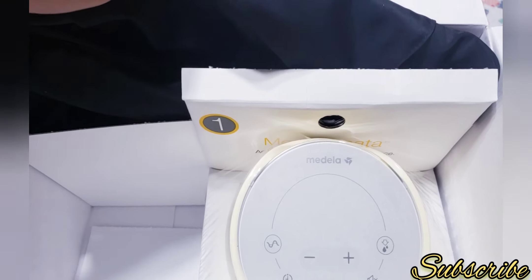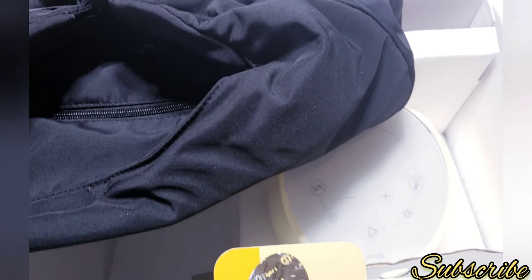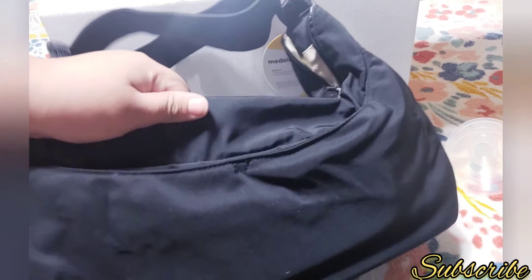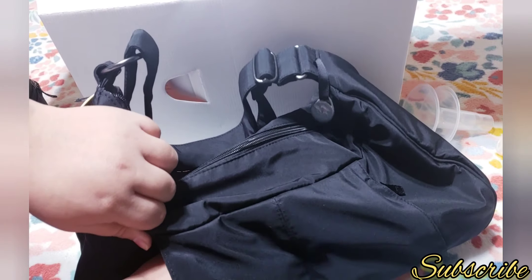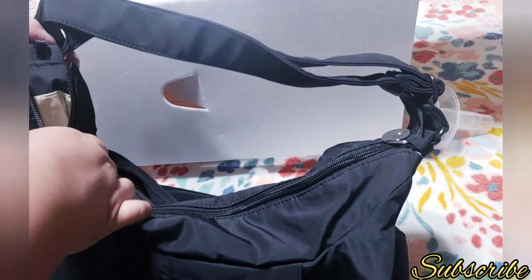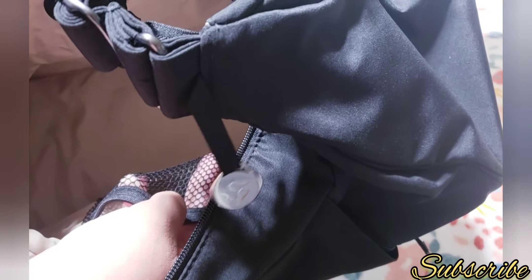The next thing is this big black item — it's the breast pump bag, so you could put your breast pump inside. This is how it looks from the inside. It has a little Medela logo. The material is really great. On the outside it has two pockets on the back and front, plus a zipper pocket where you could put something, and another zipper pocket. Inside there's a mesh bag.